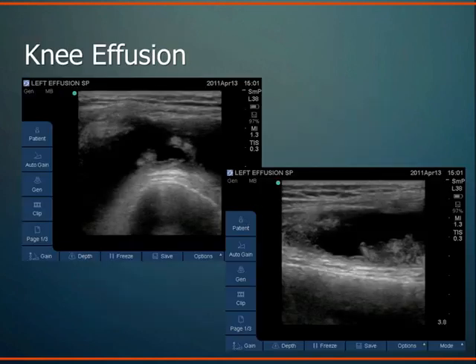This is an example, a patient I saw a couple weeks ago, joint effusion, just a classic presentation of knee arthritis, acute exacerbation, lots of pain, lots of swelling in the knee. This is the suprapatellar pouch of the joint space. The knee joint space extends pretty far above the knee in that suprapatellar pouch. When you have a joint effusion, that area can be extended or distended. And this is the fluid collection in there. So all fluid with some joint debris floating around. This is just a chronic, classic osteoarthritis presentation, seen quite well.